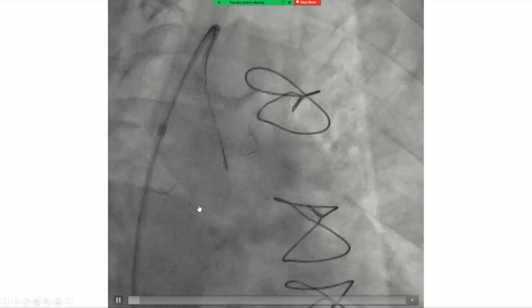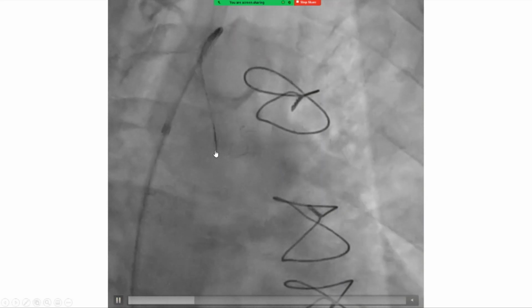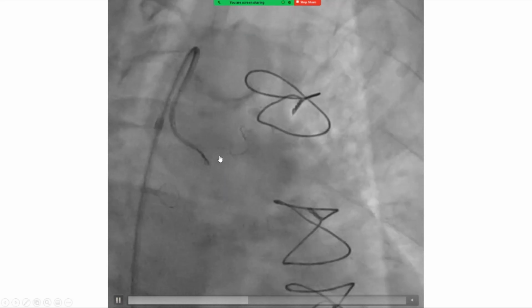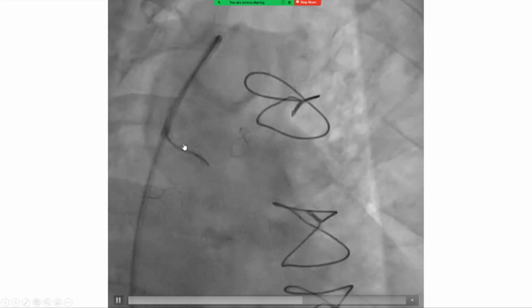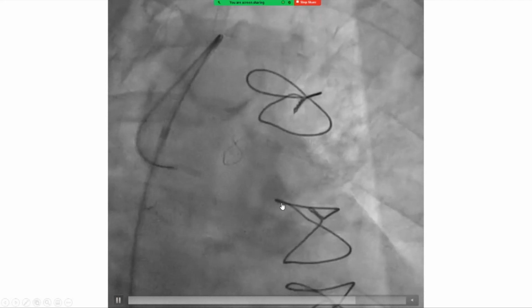This is an illustration of another case. Again, we have an elongated and free AL. We're torquing to hook that ostium in an RAO view, and once we hooked it, we pushed it to give it the duck shape and make it look coaxially upward.